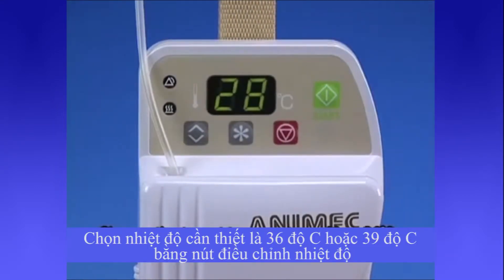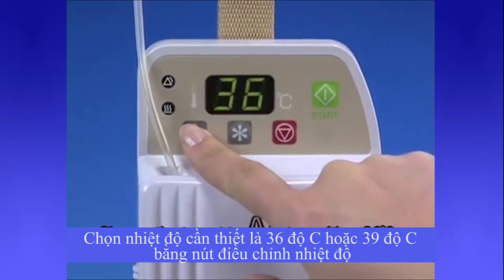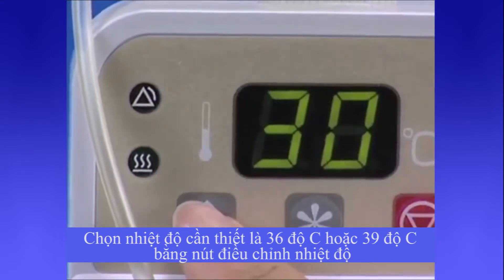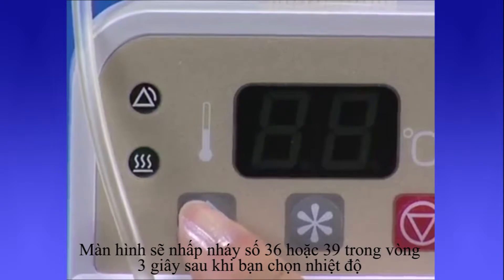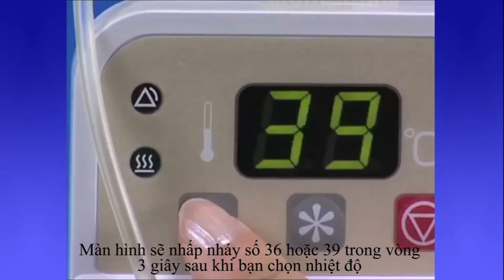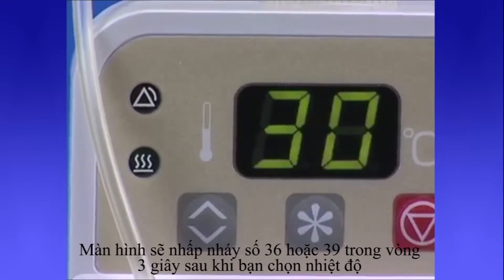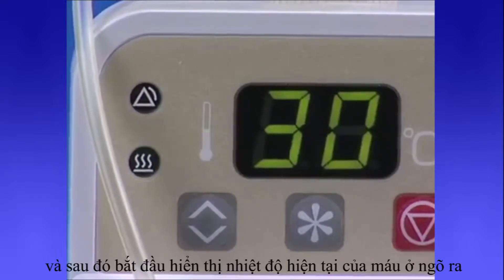Choose the target temperature, either 36 or 39 degrees Celsius, with the temperature setting button. The display alternatively flashes 36 and 39 degrees Celsius for approximately 3 seconds when the temperature setting button is pressed, and then indicates the present temperature.